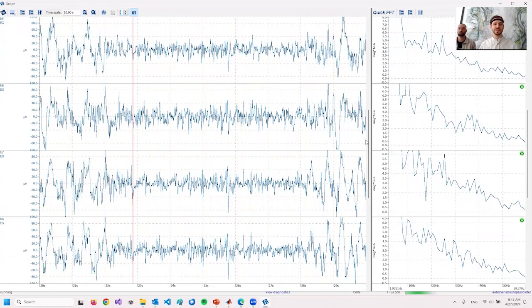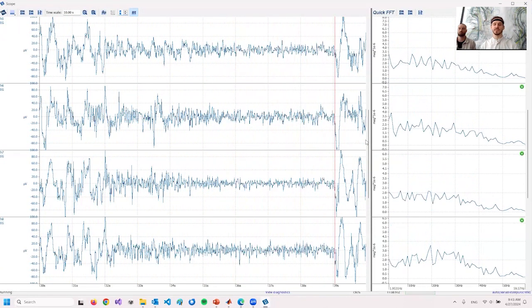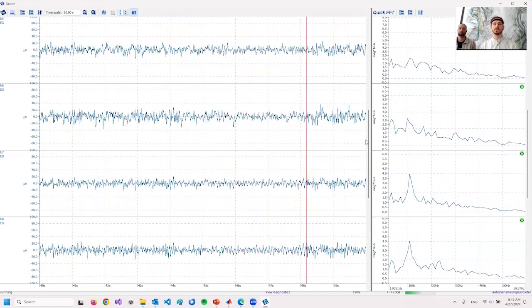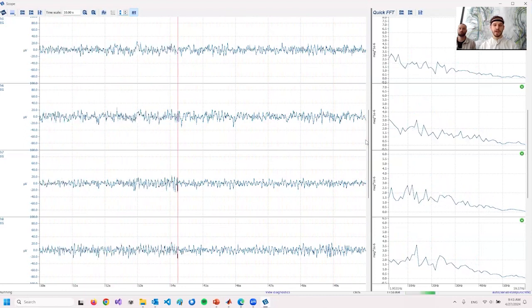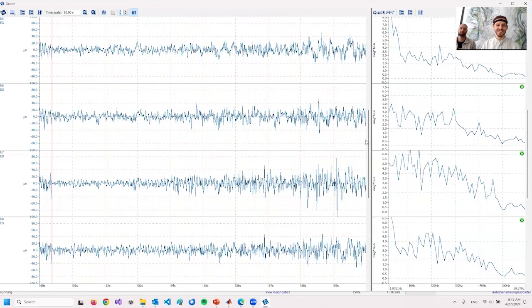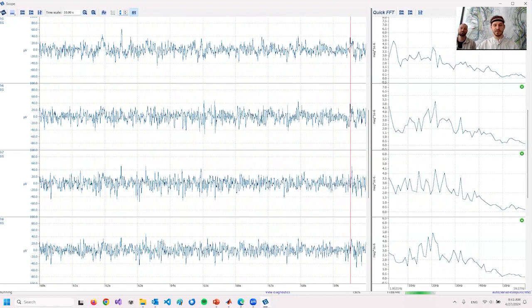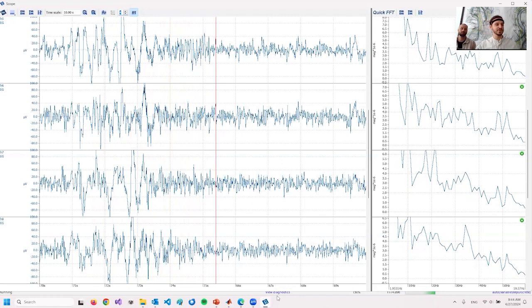Then I can also introduce some artifacts because right now I'm measuring with dry electrodes. And then I can wait until the EEG becomes clean again. And I can try to close my eyes for a couple of seconds. We can see some small alpha because I don't have much alpha signal. I'm a bit nervous right now. But as you can see, we can measure time series signals and frequency spectrum in real time with this headband. And right now I'm wearing it with 4 electrodes over my visual cortex.